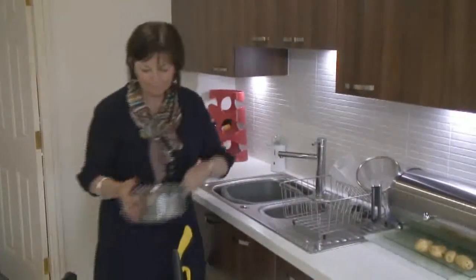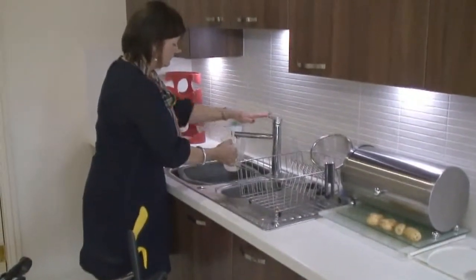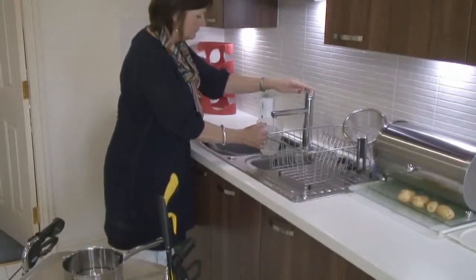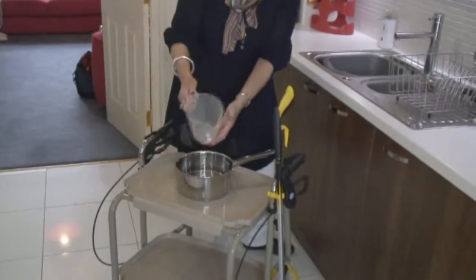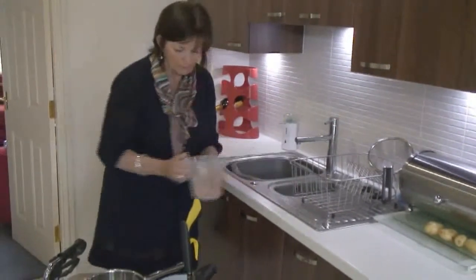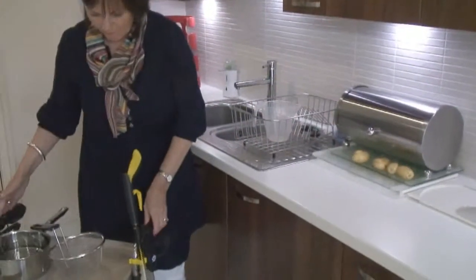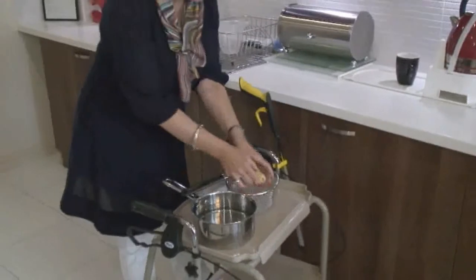Again, we're going to look at items to assist with mobility and safety in the kitchen. Here Brenda is demonstrating the use of a trolley, which can help to carry hot and heavy items around the house, or to move from one location in the kitchen to the other. What Brenda's done is put the pan onto the trolley and is now filling it bit by bit from the tap via the jug. What this does is eliminate the need to lift a pan full of water. So now, taking our vegetable basket, this can be brought across with the vegetables put into it. So you can move along, collect your prepared potatoes, and this can now be taken across to the cooker.